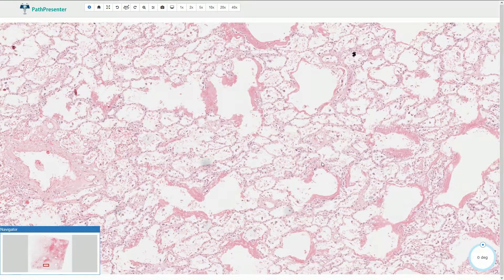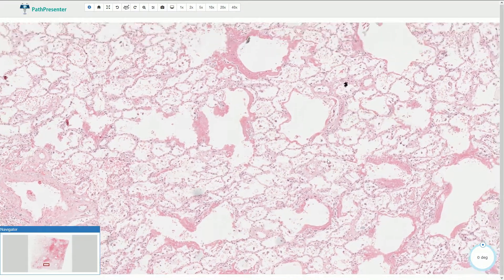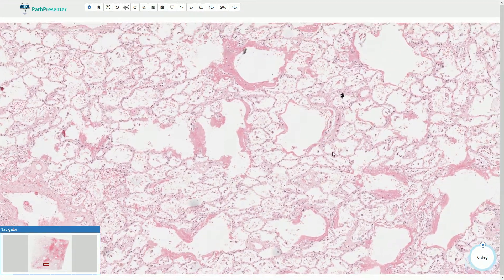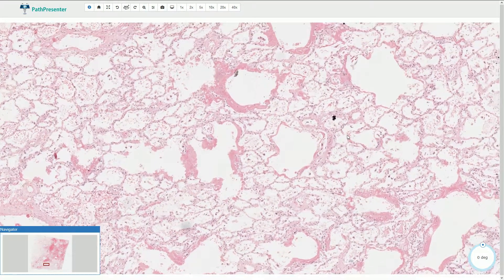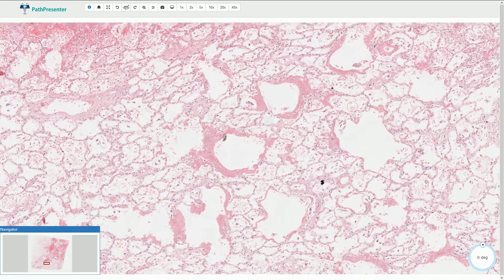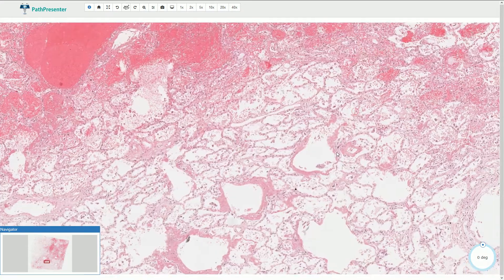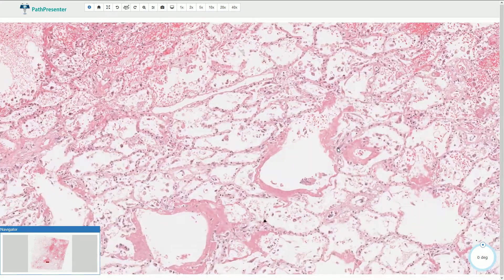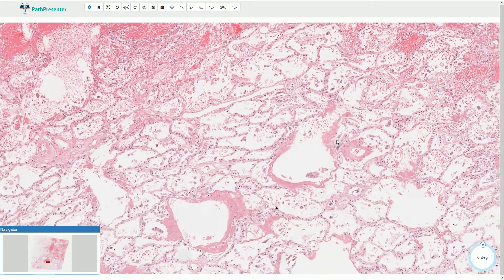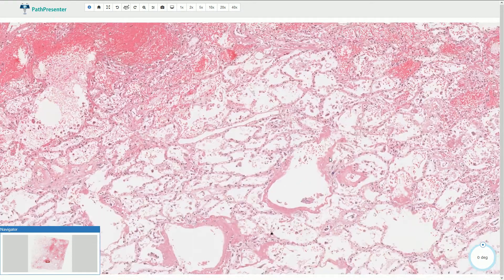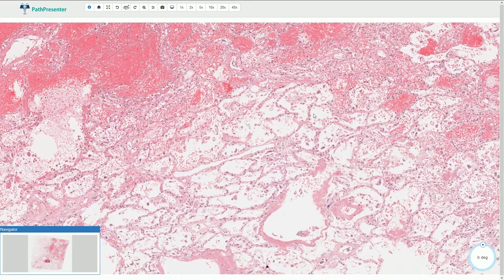I have already done a video about ARDS and diffuse alveolar damage, so I recommend to watch it. Let's find out what is the cause of diffuse alveolar damage in this case.